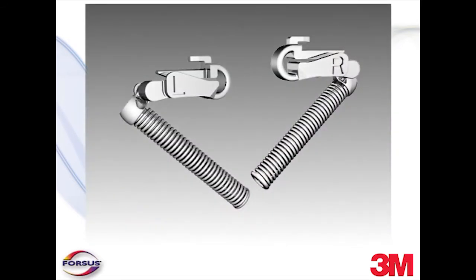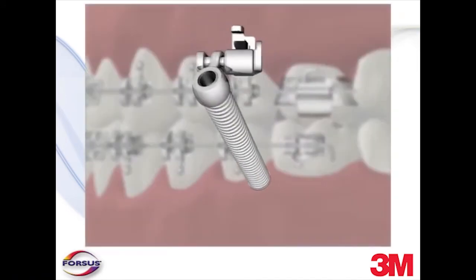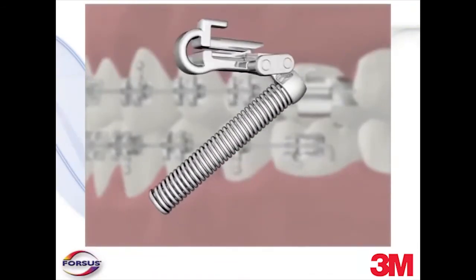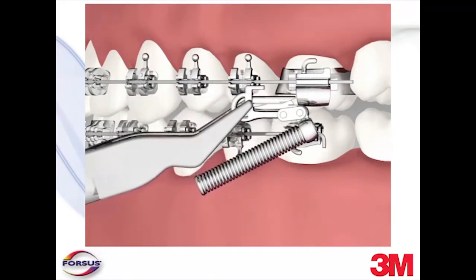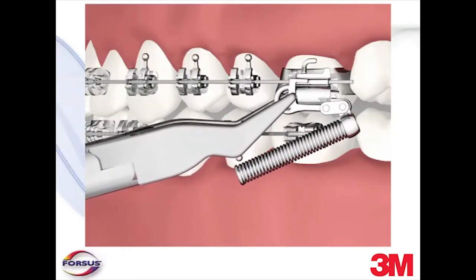There is a right and a left EZ2 module as indicated on the stability plate. The side of the plate that displays an R or an L faces to the lingual as the plate is inserted behind the headgear tube. Holding the mesial end of the EZ2 module with Weingart utility pliers, insert the EZ2 module clip into the headgear tube from mesial to distal until it clicks into place. Be careful not to come in at an angle — push straight distally.